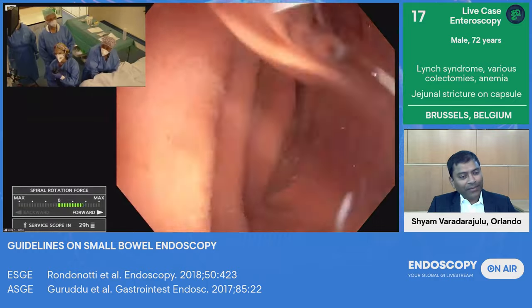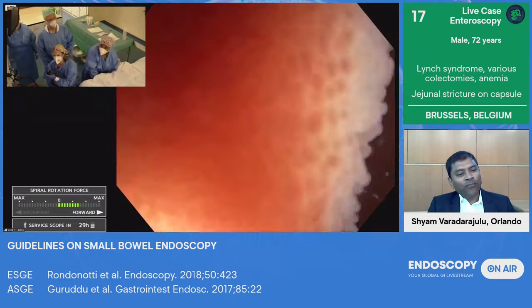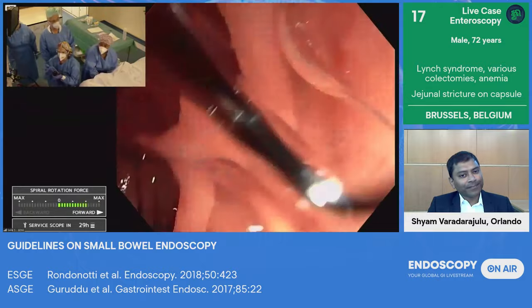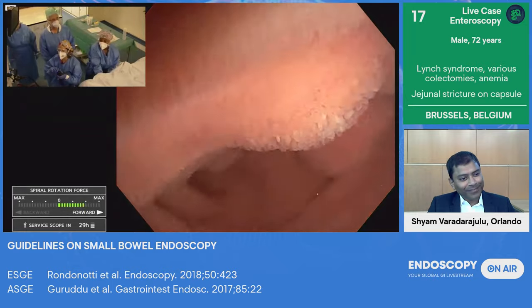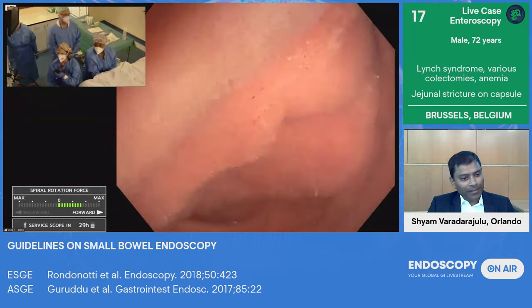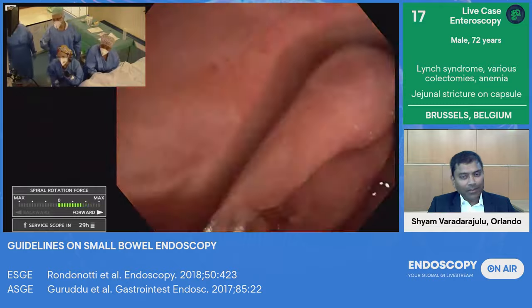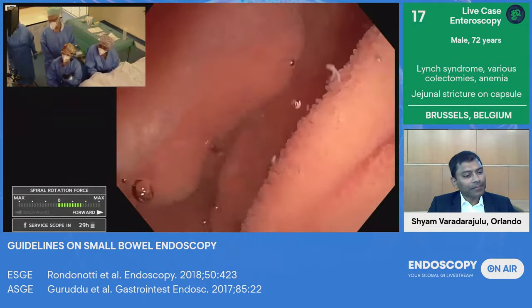We still don't have the scope in the United States. So do you have the problem of the scope falling back, and are there tricks to fix it in an open position? I didn't have it falling back, but with the help of the forward movement, it stays quite fixed. So this is probably one of the advantages when we don't want to do a therapeutic approach: with this forward movement, which is applied on the tip of the scope, you have a relatively good stability.